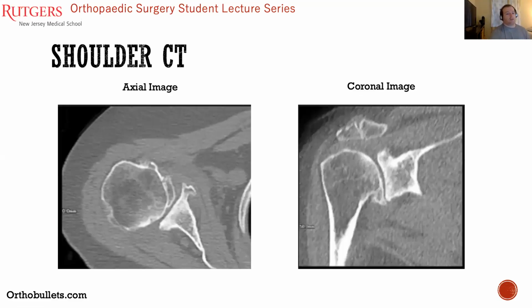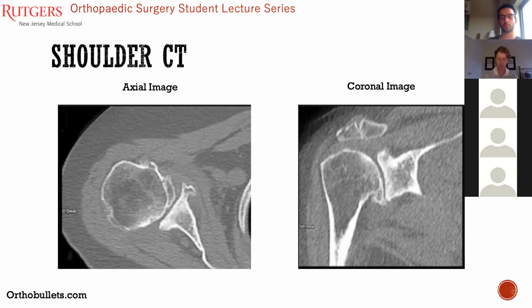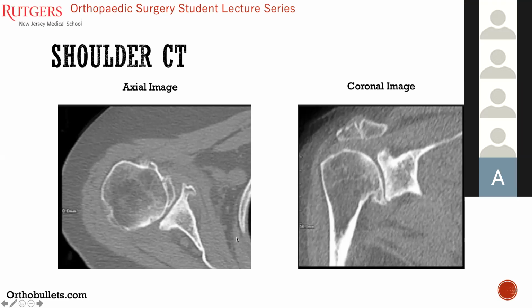Okay. So CT scan imaging of the shoulder. Outside of trauma, there are, I'd say, relatively few reasons for shoulder imaging. In the past couple of years, templating programs using CT imaging have come out for total shoulder replacements and reverse total shoulders, to help determine the placement of your implant. It will help tell you if you have arthritis that is wearing out the posterior aspect of the glenoid. You may need some bone augments.